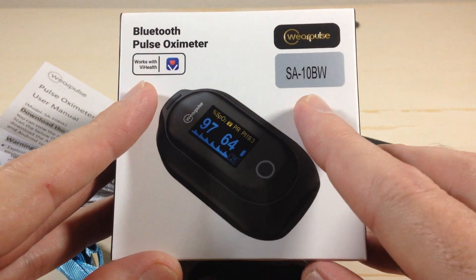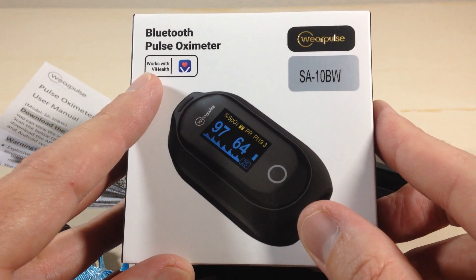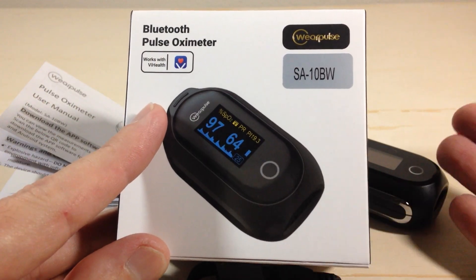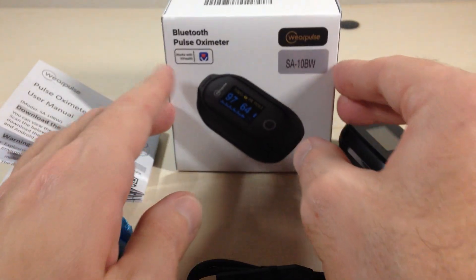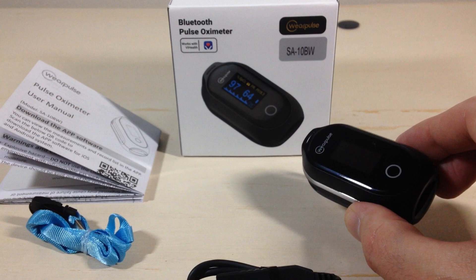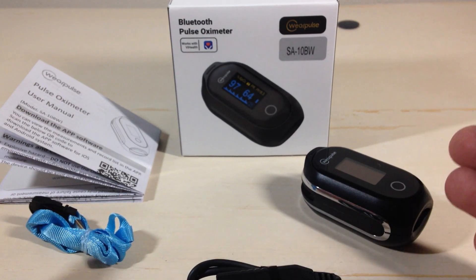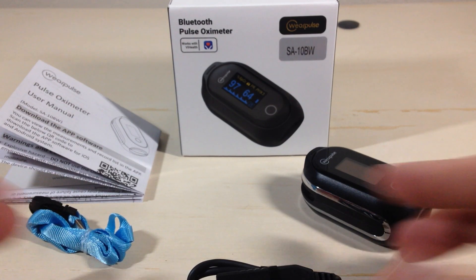This is the model SA-10BW. It's Bluetooth and works with the ViHealth app — I'm going to do my best to show you how it looks on the device as well as in the app. You do not have to use the app if you don't want to. If you strictly just want to use it as a pulse oximeter, that's perfectly fine. The app is free, and if you create a free user account it will store your historical information and give you some analytics.